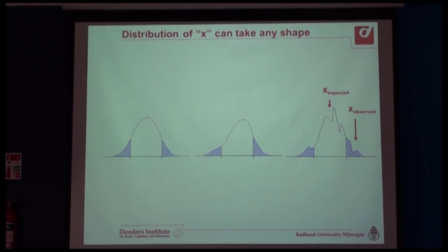So that means that if we permute, we don't care about the bias, as long as we keep the same number of observations in each experimental condition. So that's why we normally permute. It's also possible to randomly reassign, and FieldTrip can do that, but we permute. The permutation is just a subset of randomization.